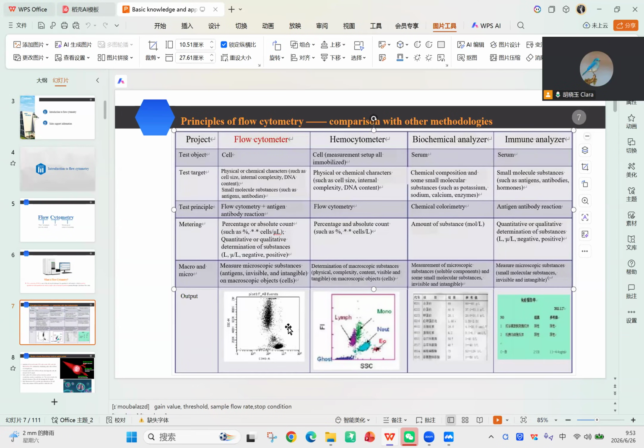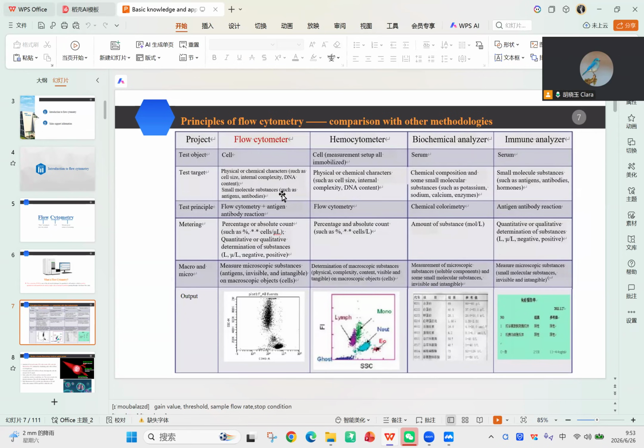They use the same principle here. But I think you already know the hematology analyzer well, so I'd like to introduce the differences between the two machines now. We know the hematology analyzer uses blood to detect directly, actually.